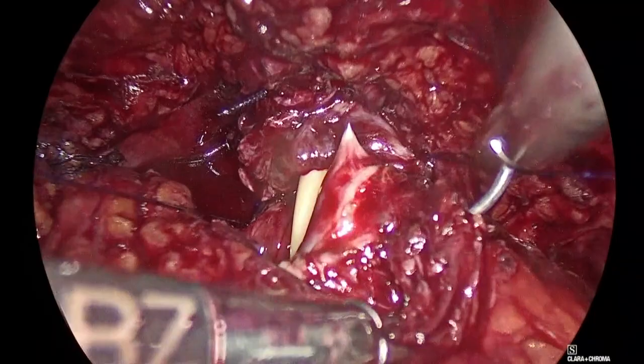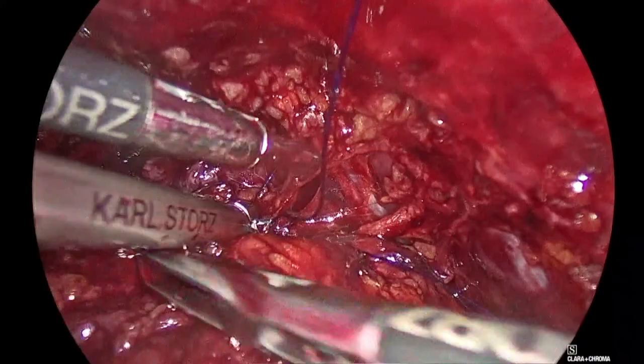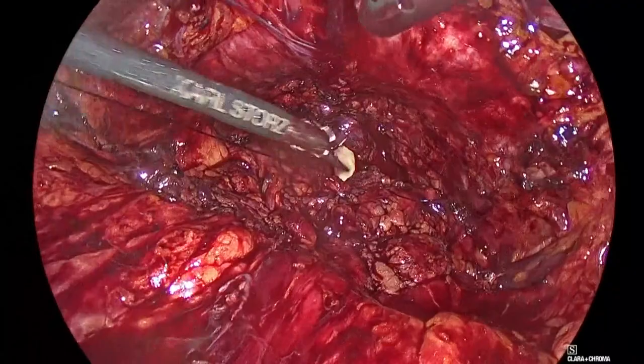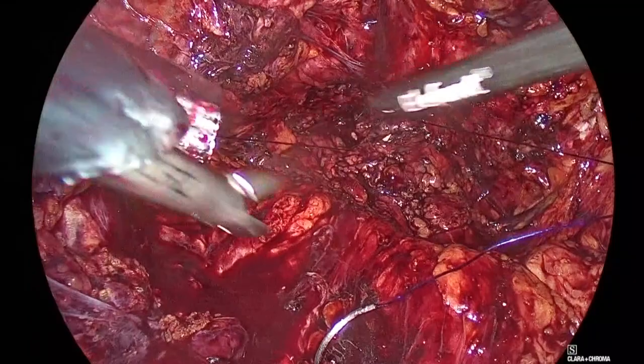Release, Panagiotis. Good. Come, help me here. Here. Good. So you need to be very close on the mucosa on the orifices. So far away from them with the mucosa. No, wait. Go back. Okay, good. Grasp it. Back. Here. Go inside your trocar. Good. This is done with one side for the moment.